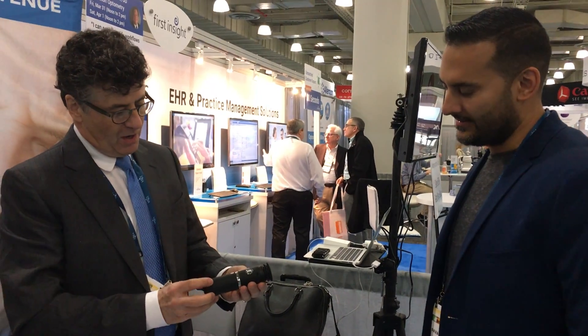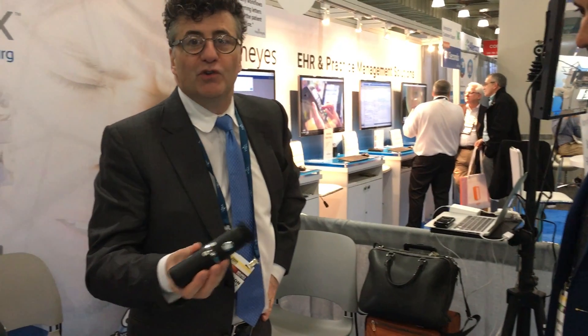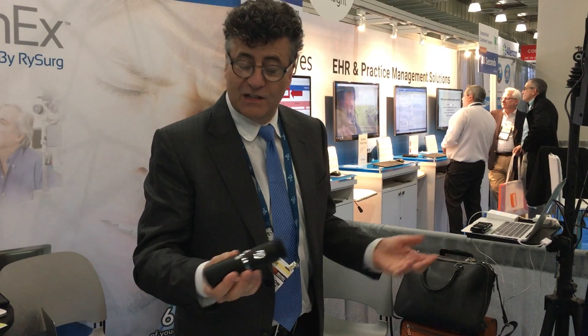We're going to do a demonstration of the Lashcam and how to use it in your practice. It has lots of uses — you can use it in the classroom, during makeup application, during padding, lash extensions, all kinds of uses.